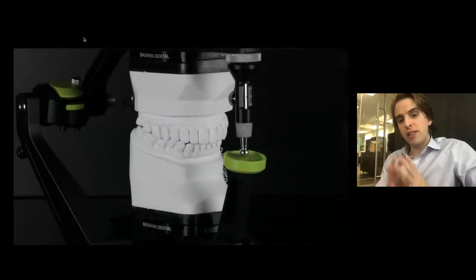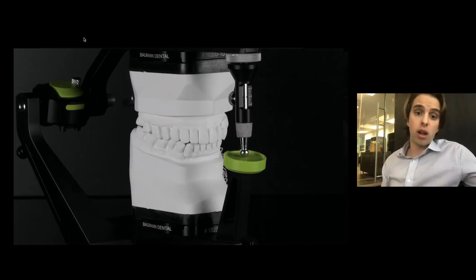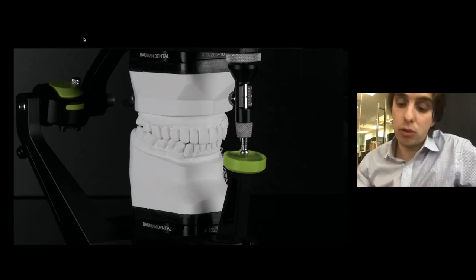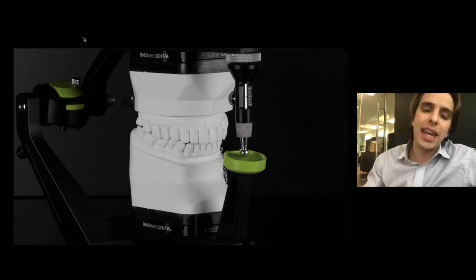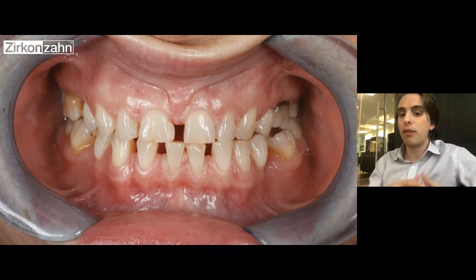And so now we've established the technical project both in the digital lab space as well as the conventional lab space, and we begin our prototyping. And if we want, we can start with a simple non-invasive appliance. So let's say a patient presents like so. The patient's overclosed, they're missing some teeth, there's gaps in the teeth, they have some serious abrasions going on.